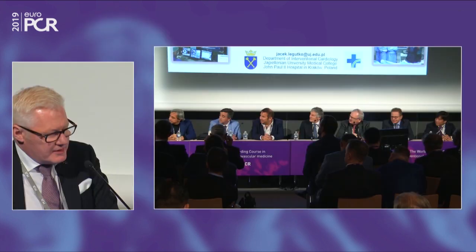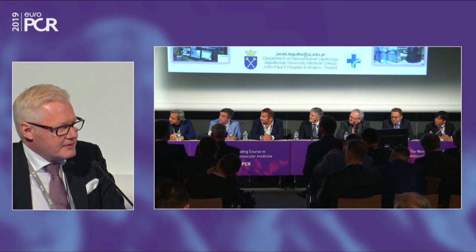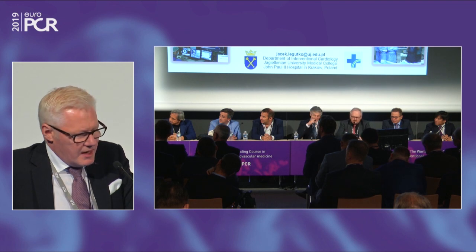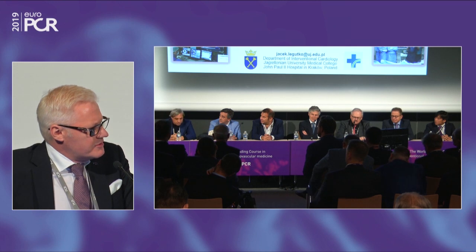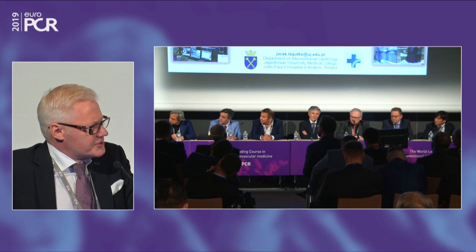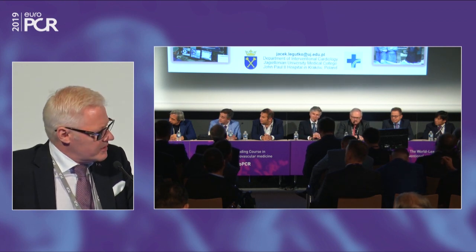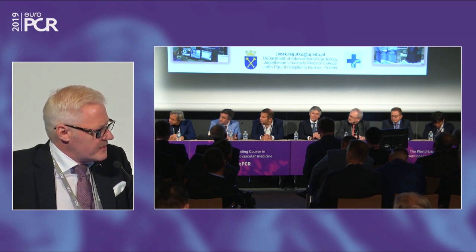So following the advice from Robert, who, you know, implanted the highest numbers of stents, so he's got experience, it's good to implant this stent with not very high pressure, so it means that you need to post-dilate with additional non-compliant balloons. And not only in the proximal part, but it is also good to optimize the implantation in the distal main vessel, so it means in the bifurcation of the left main, usually in LAD. So I did this as part of the final kissing balloon inflations, yes.